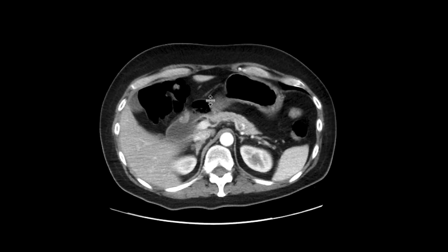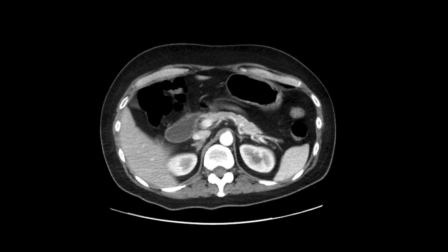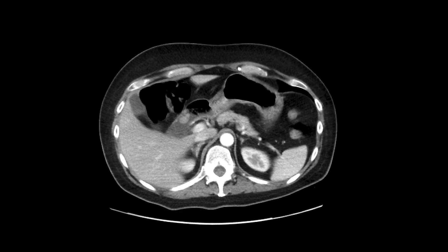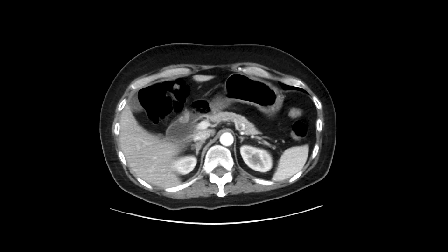You look at the attenuation of it and just the appearance of it in terms of its structure — it is very similar to pancreatic tissue. And given the location of it and given its appearance, the imaging appearance is very characteristic of ectopic pancreatic tissue.